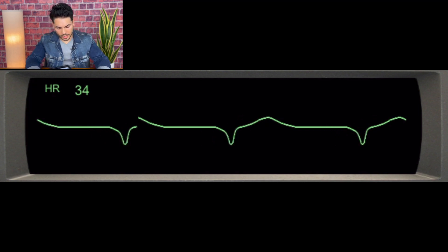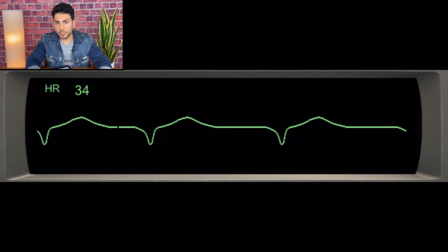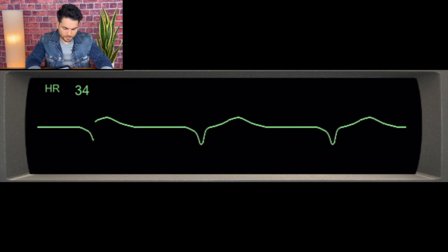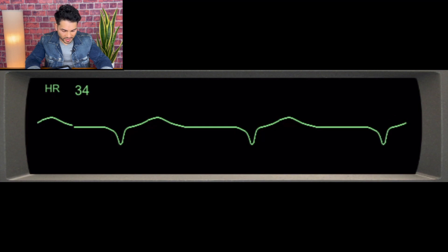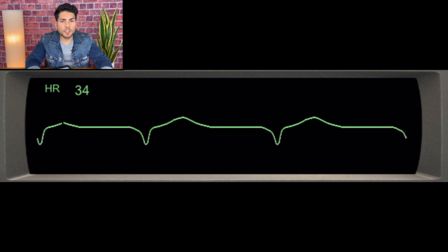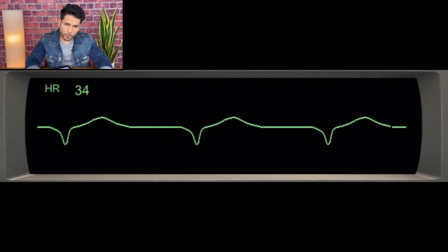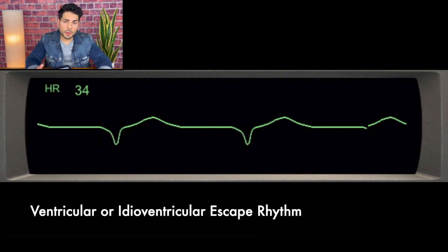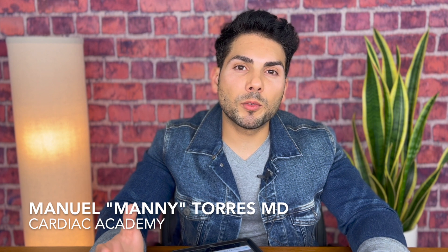Next example. P waves? No, there are no P waves. Is the QRS narrow or wide? Wide QRS. Is the rhythm regular or irregular? Very regular. However, it is very bradycardic — the heart rate is 34. The ventricular intrinsic heart rate is 30 to 45, so it's in that range. We see a wide QRS and no P waves. We can conclude this is a ventricular escape rhythm, also known as an idioventricular escape rhythm.